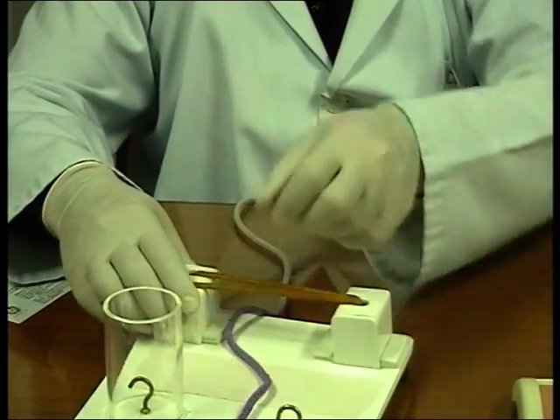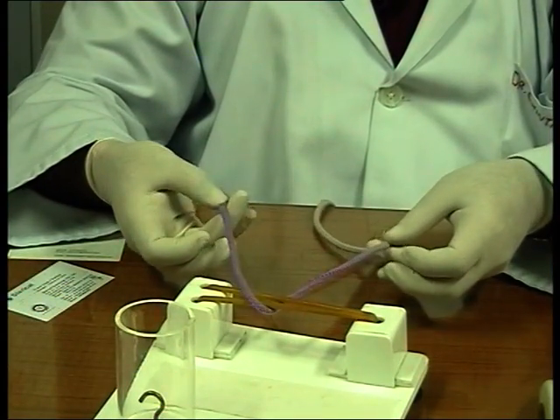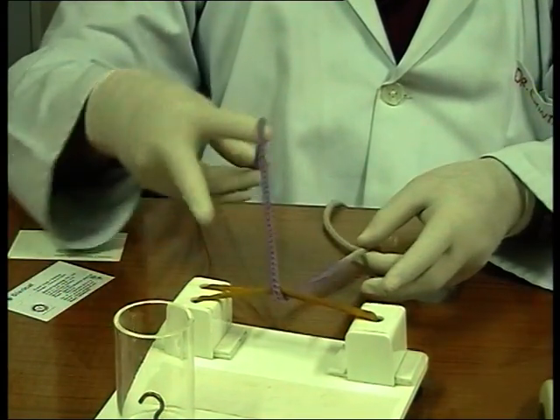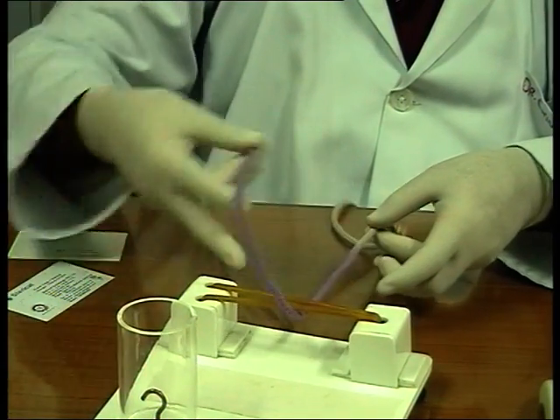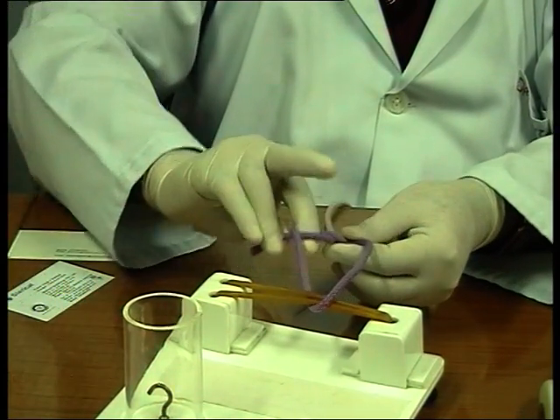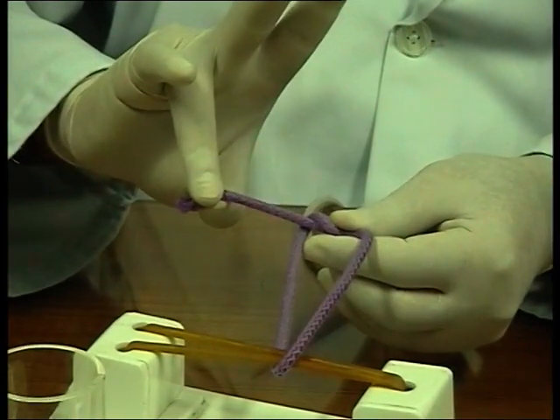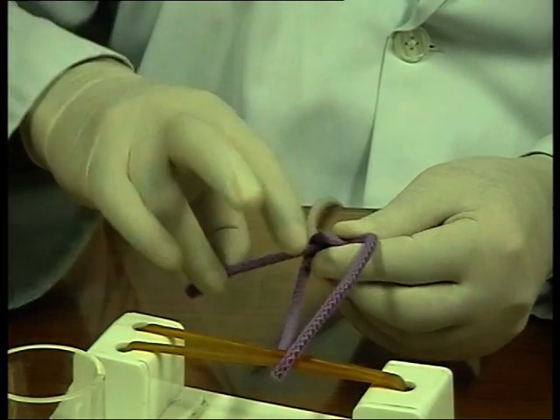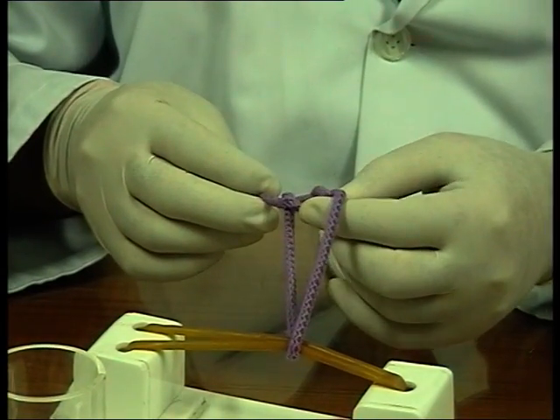The short end is away, long end is towards me. I'm supposed to use an index finger throw. I hold the thread between the ring finger and the thumb. Use the index finger to make a figure of 4. Hold the end section. Use the index and middle to draw it out like this. Hold it again. I started like that and back to that position. Do it again, actually 2 throws through the same loop.